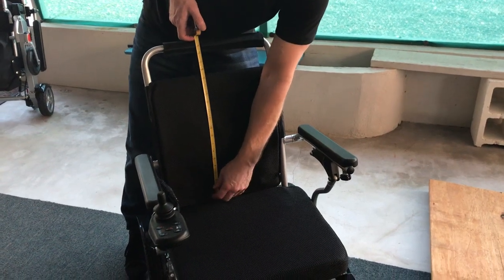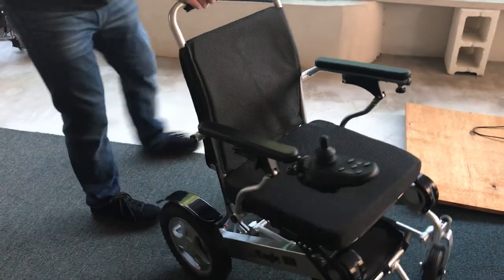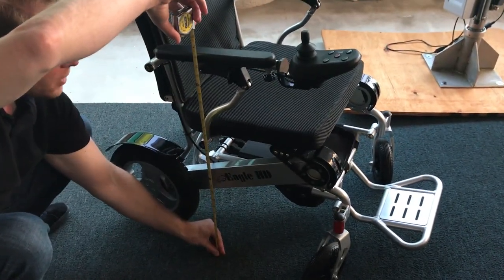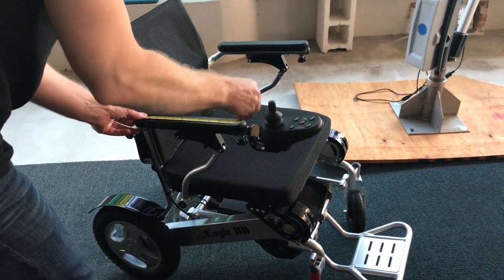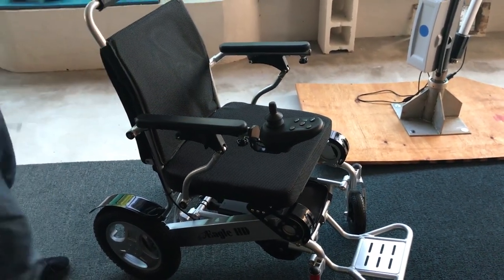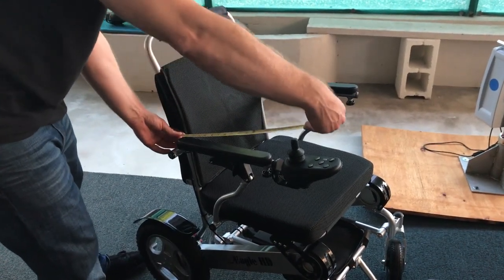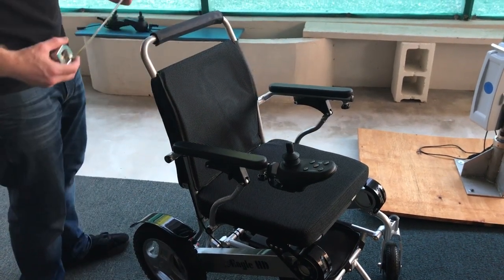From the top of the arms to the ground we have about 27 inches, and each armrest itself is about 12 and a half inches long — the same as the Air Hawk. From the back of the chair to the actual joystick pin is about 17 and a half inches.